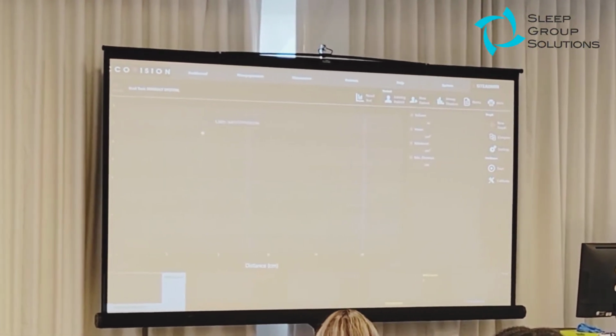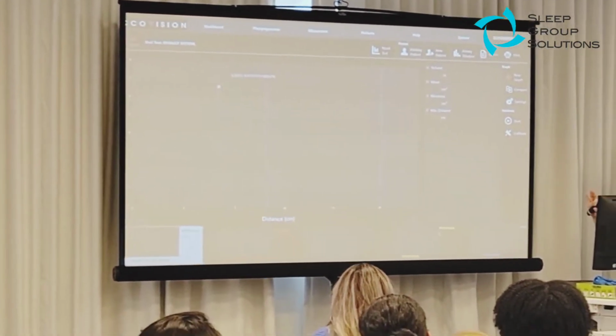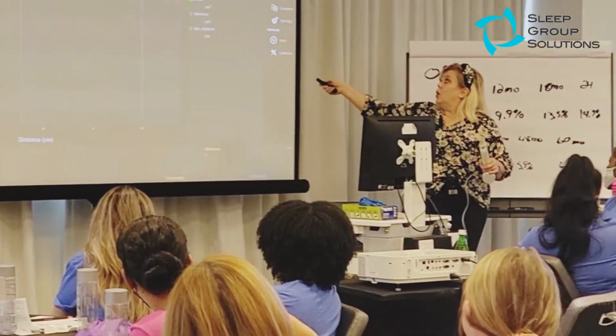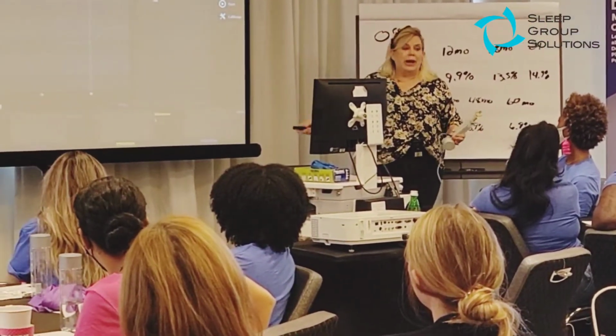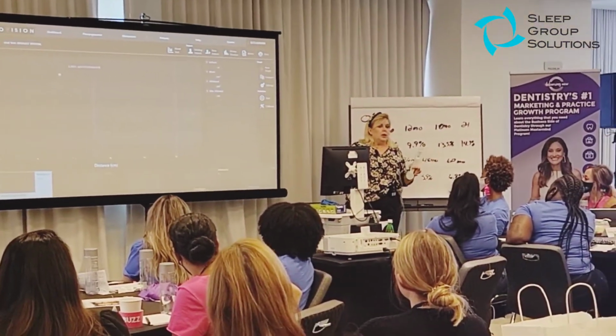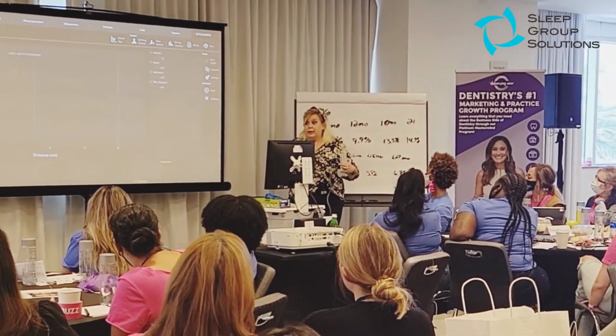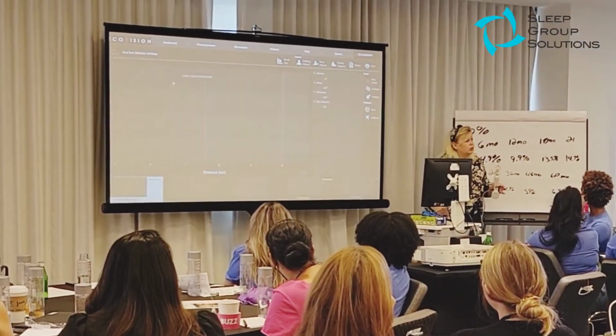Close. And medicine is like horseshoes and hand grenades. Sometimes close is good enough. So, the mean airway for a female is about 2.8. So overall, my airway is kind of okay, not normal. I don't snore when I'm awake. I snort when I laugh. But when I'm awake, I don't snore.